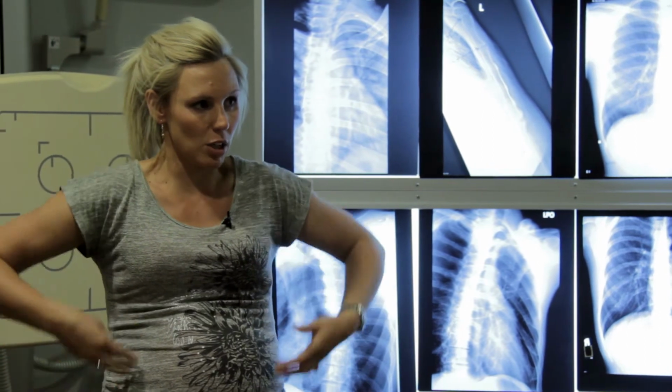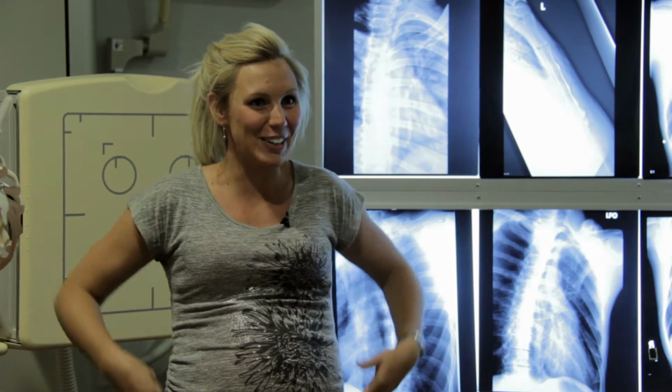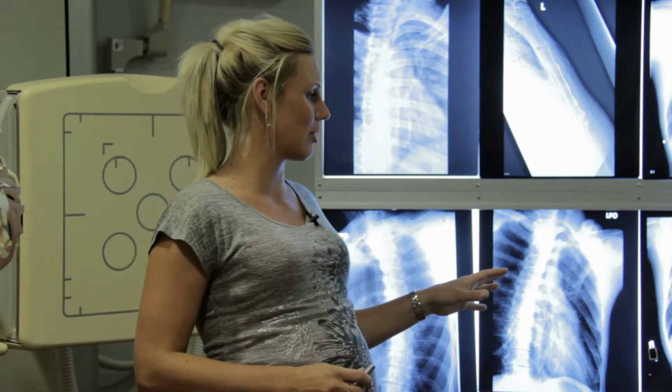Another one I've been seeing is little old ladies that wear their pants, and we actually see underwear artifact and pants artifact in the lower ribs. Slide them down. We now know where the lower rib margin is, but be really extra cautious because these pictures are coming out, if you use the right technique, with really good detail because we're at 72 inches. So be extra cautious of any little thing that might cause pinching of the skin or any kind of artifact.